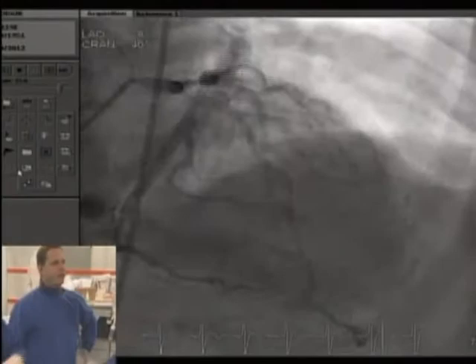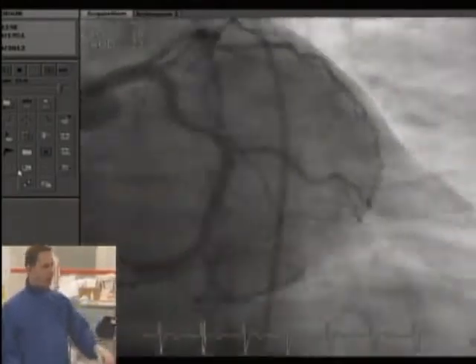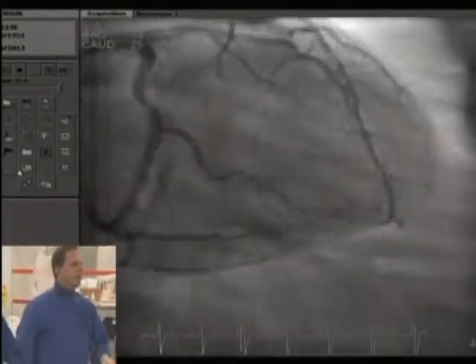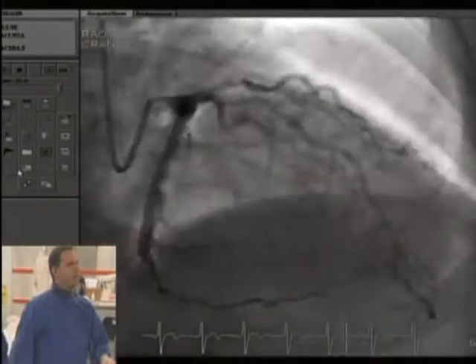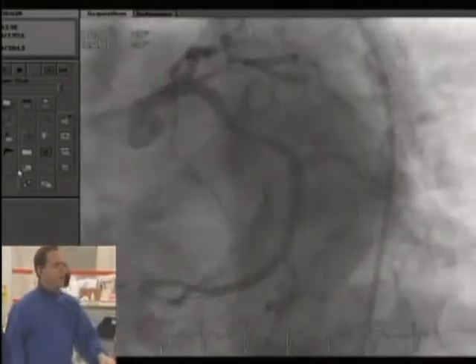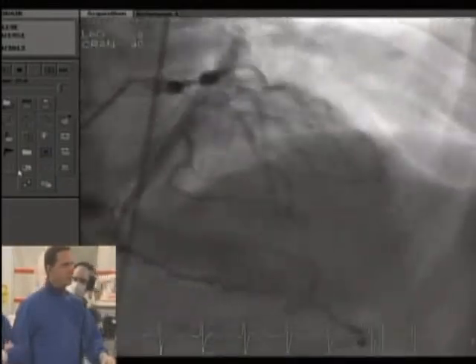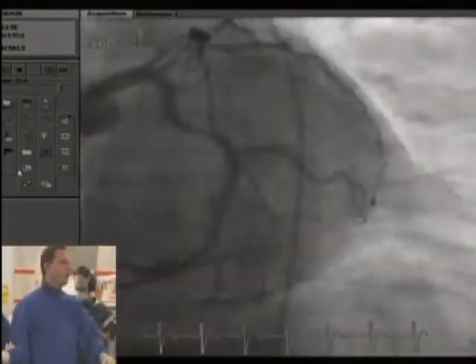We got this nice software that we have been using over the last days and weeks from Philips. With one injection, you can see the whole coronary tree in a swing way. I still don't have the audio back.